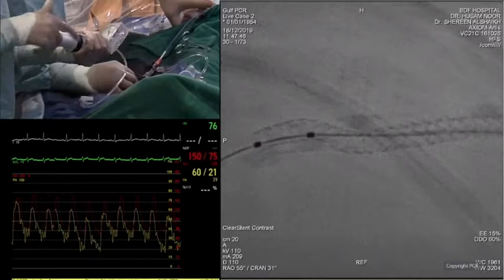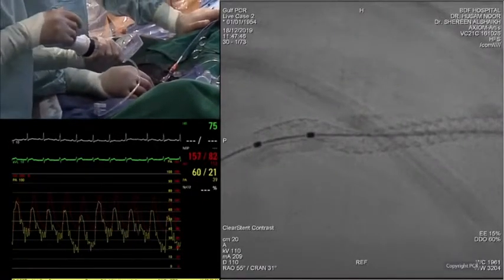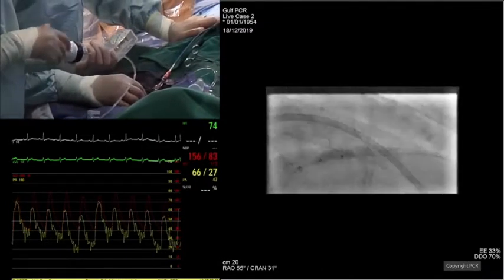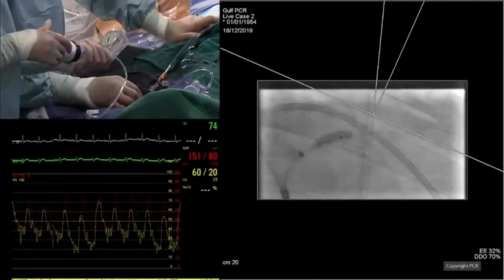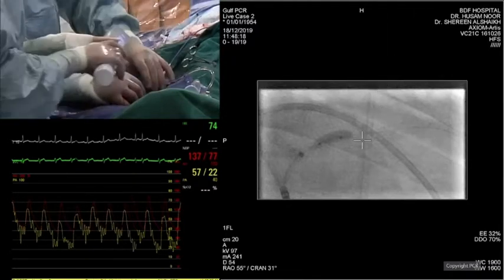Well, you can see the calcium on the stent booster. It's just outside. But you can see the expansion of the 4-0 balloon. Here we go. Very nice. Down. OCT. So down 12.